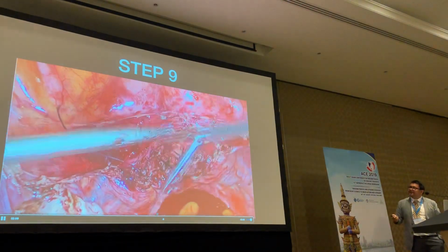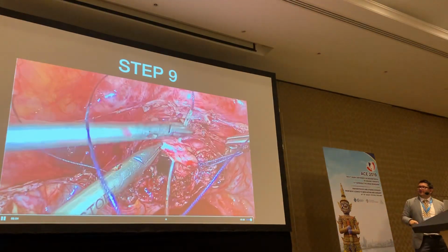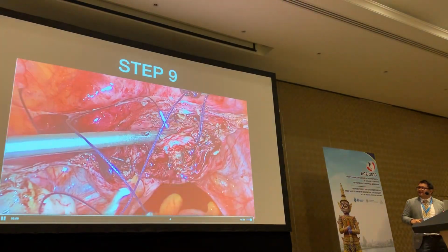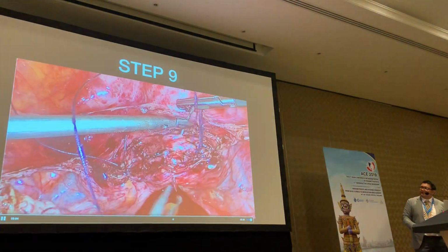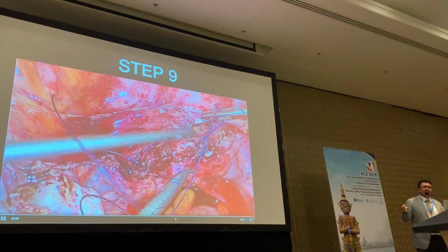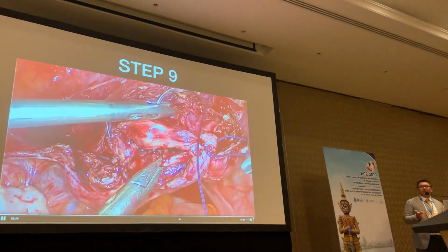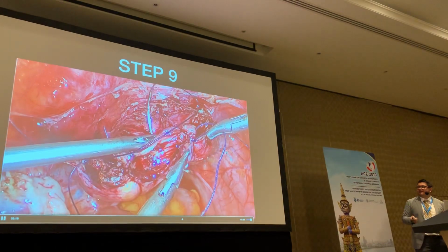Once you get that angle, then I switch back to my left hand so I can watch the needle come through in its full thickness here. So this is wrong, this is not full thickness. And then I will go through and take this. If you've got a very thick vagina and you're using a smaller needle, you will take 2 layers. There's no need to try and do it all in one swoop. You can use 2 layers, there's nothing wrong with it.